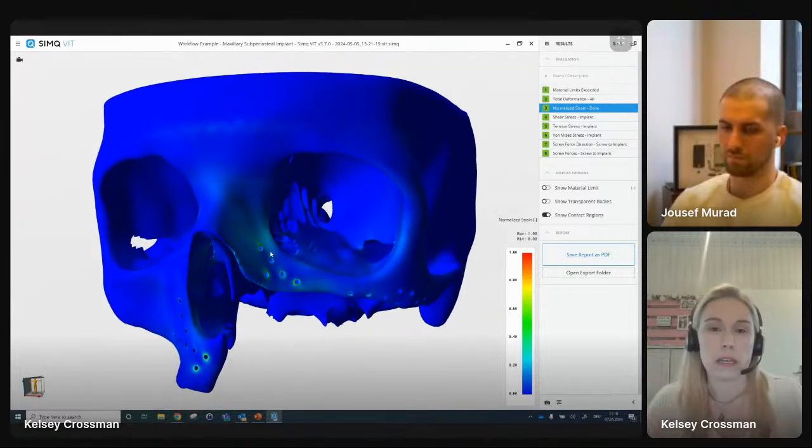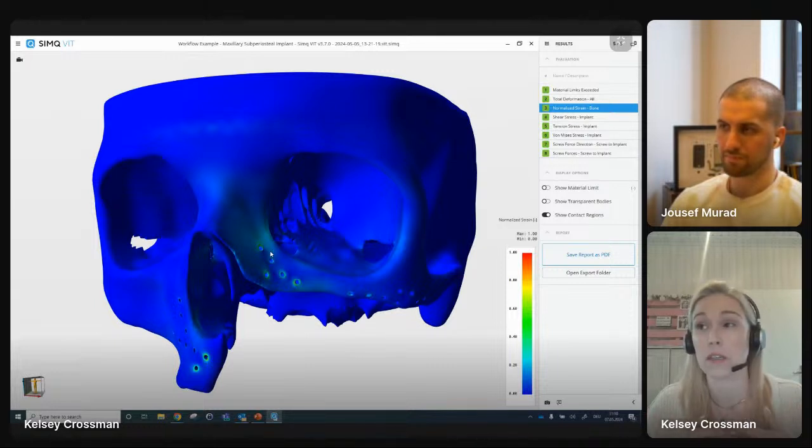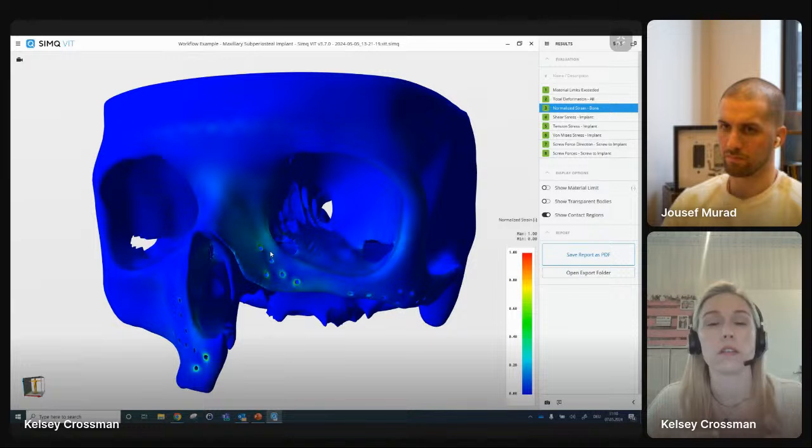Because medically, when a bone takes too much force or not enough force, you can have bone growth and you can have bone waning. If the pressure is not enough on a bone, just like if you don't do weight training exercises, you can lose bone that way. So it's very important how these pressures are placed, not only with the implant design, but on the bone.